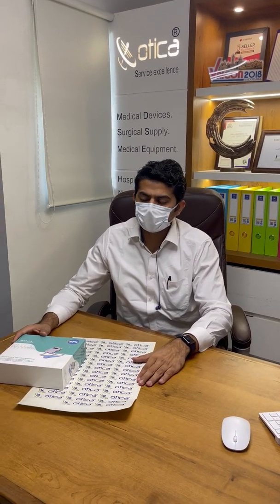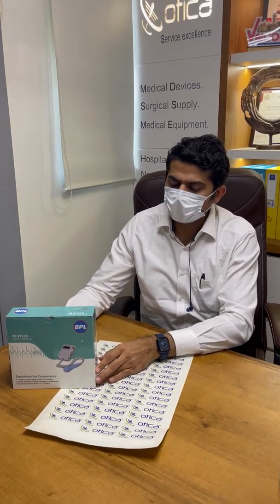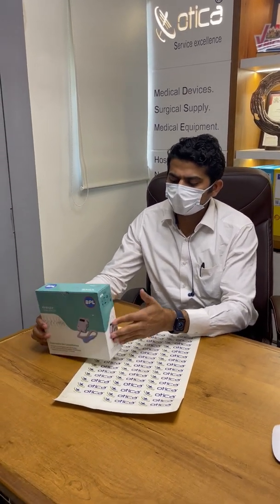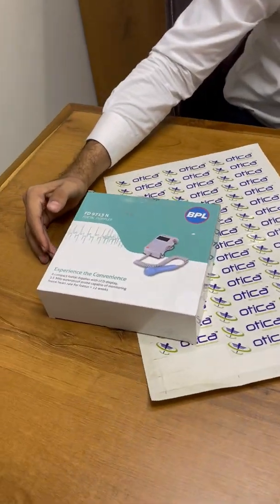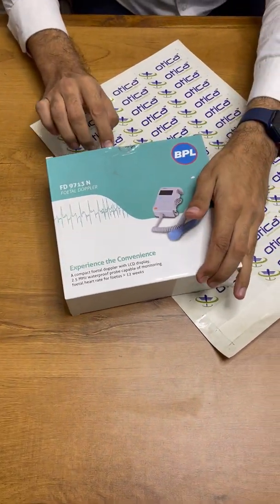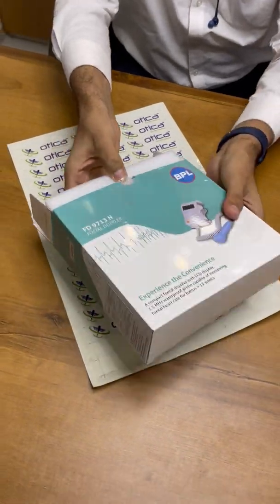Welcome to Otica Meditronics Company. Today we are going to demonstrate an unboxing of the BPL Fetal Doppler. The model is FD 9713 N and this is the professional level model. This device is widely used by gynecologists, but in some cases patients are also keeping this machine at their home for regular checking of fetal heart rate.